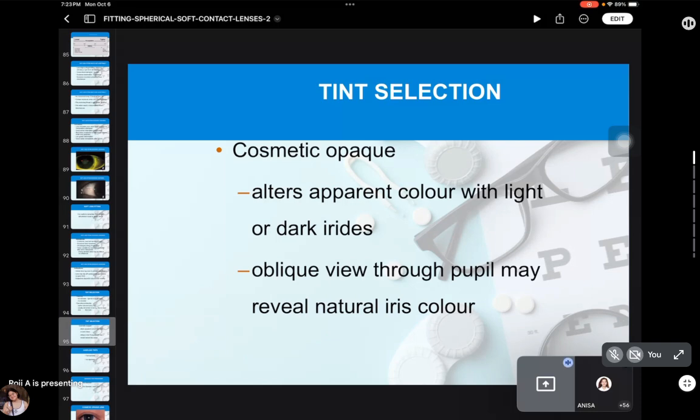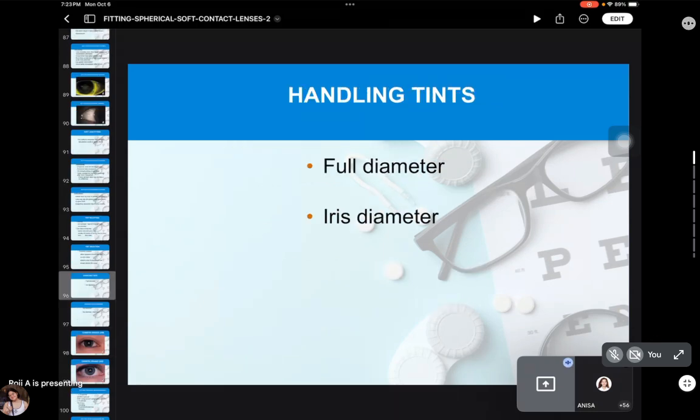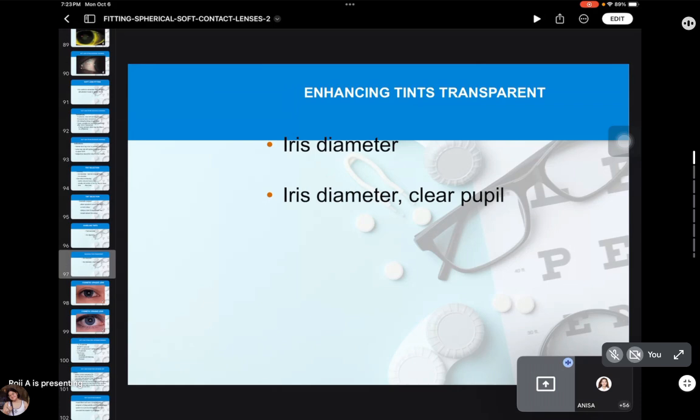Hindi, Doc. Very good. Kasi nga, wala ngang tinting. Kaya dapat itint mo, para pag nalaglag, ayun o, medyo bluish. Nakita mo differentiation niya. Kaya, ayan si handling tint. Okay ba tayo doon? Okay ba yun? Alright. Yes. So, ayan Doc, si enhancing. Na-explain ko na yan.